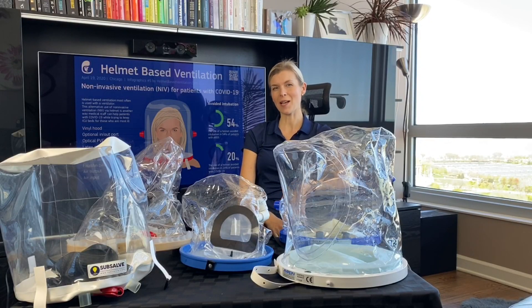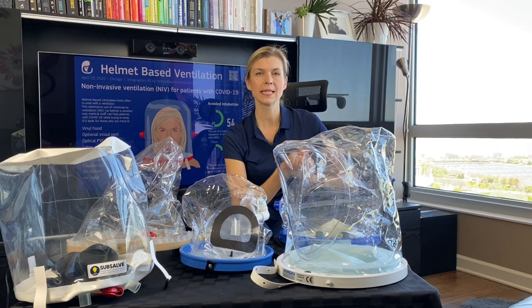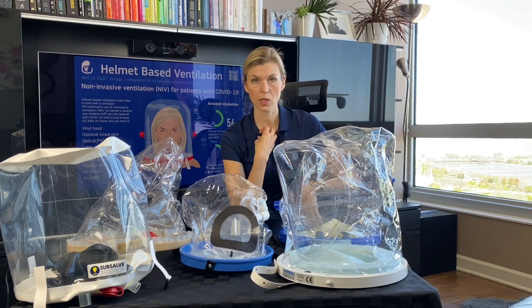Hello, my name is Audrika Sevetskajda. I'm a co-founder of HelmetBasedVentilation.com. Here we have five helmets that are made in the U.S. Today is May 9th and I will give you a quick review about all these helmets and give you my personal opinion about which helmet I would like to use on a patient for non-invasive ventilation.